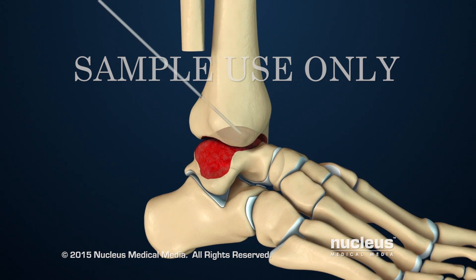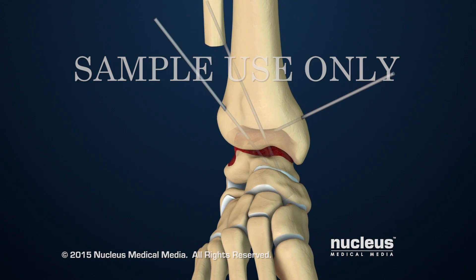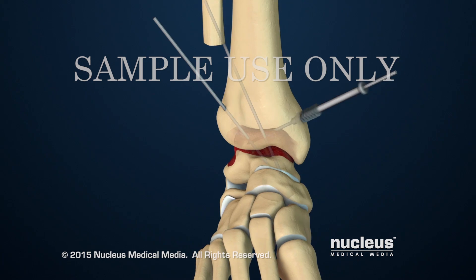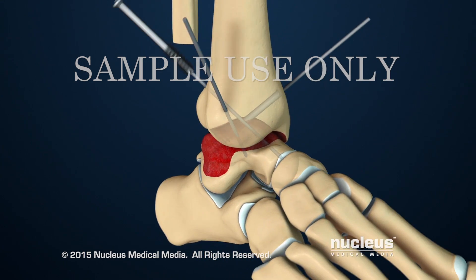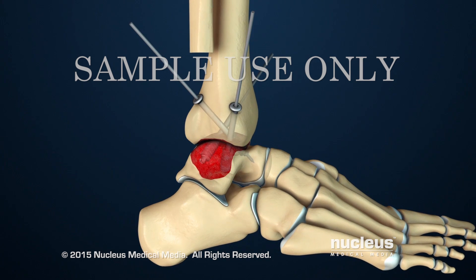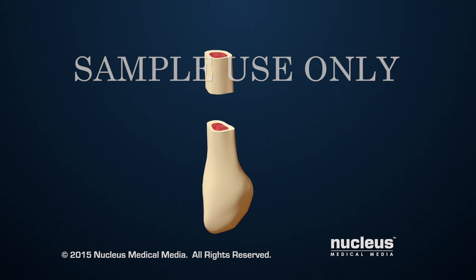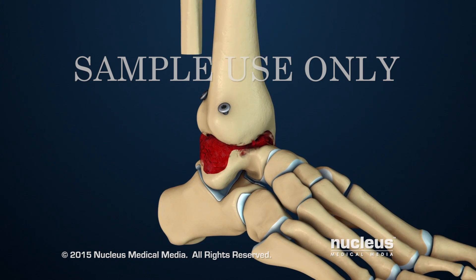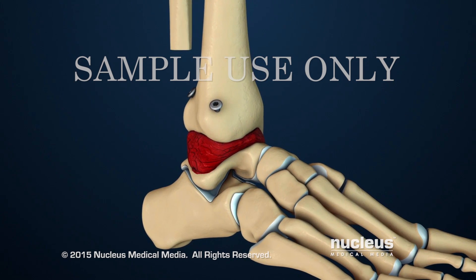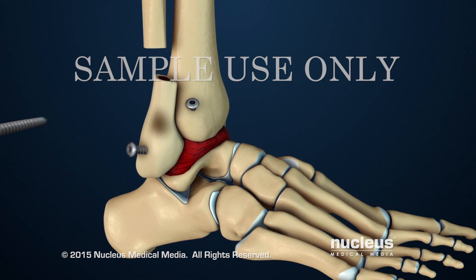Then, two or three metal guide pins will be placed through the bones of the ankle joint. The surgeon will use the guide pins to place hollow screws which will hold the bones in place. Bone graft tissue from the part of the fibula that was removed will be placed around the joint. Then, the rest of the removed fibula will be attached to the side of the fused ankle with two screws.